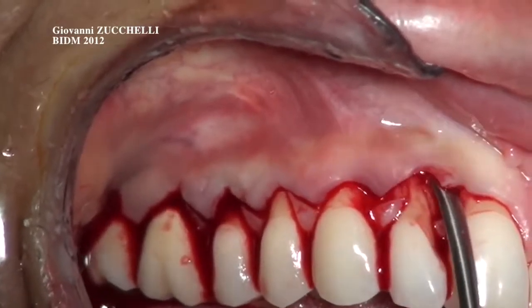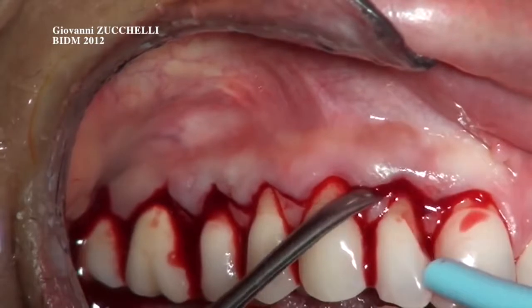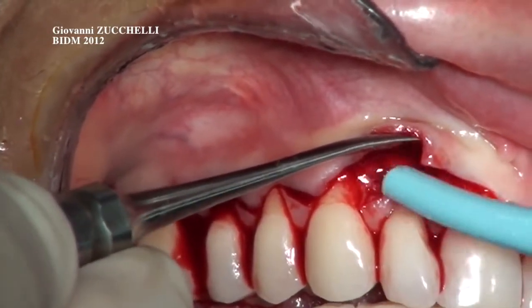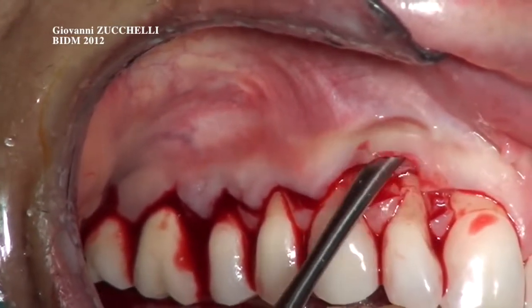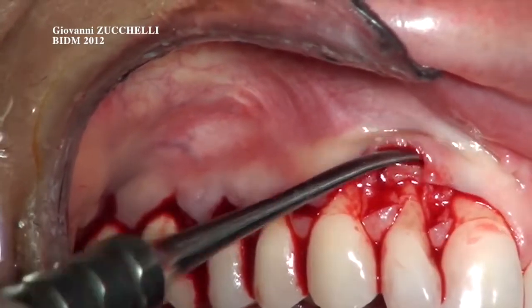You don't have to force this tissue, but just first of all, reach the bone crest, please suction here, and once the bone crest is reached, you go apically for about 2 to 3 millimeters in order to incorporate some periosteum to be coronally advanced.